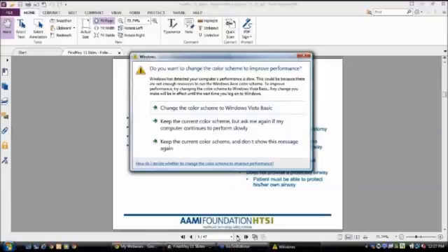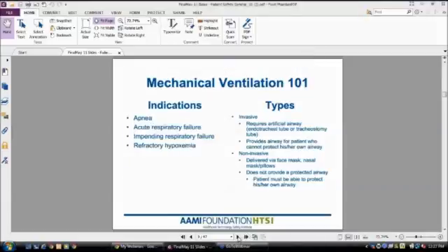have some alarms as well that would fall into these categories. And remember, the big difference between invasive mechanical ventilation and non-invasive, of course, is the presence of that endotracheal or tracheostomy tube. It's very important, of course, that we evaluate to make sure that our patient can protect his or her own airway.